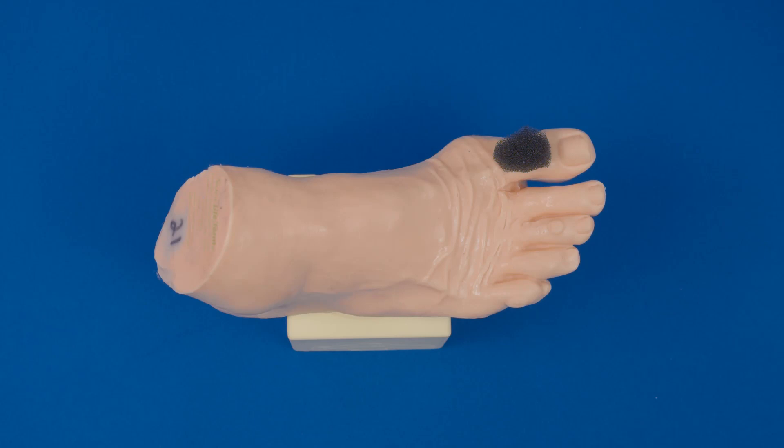Foot and toe wounds are typically very difficult to get an airtight seal. Skin on many feet is compromised, thick, and sometimes moist.